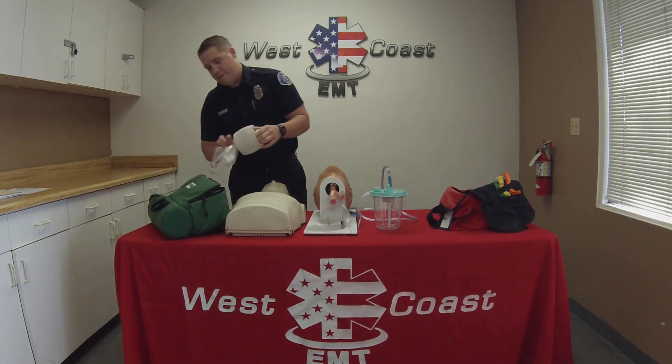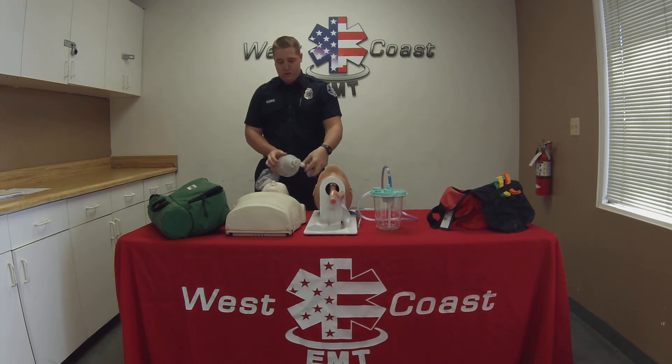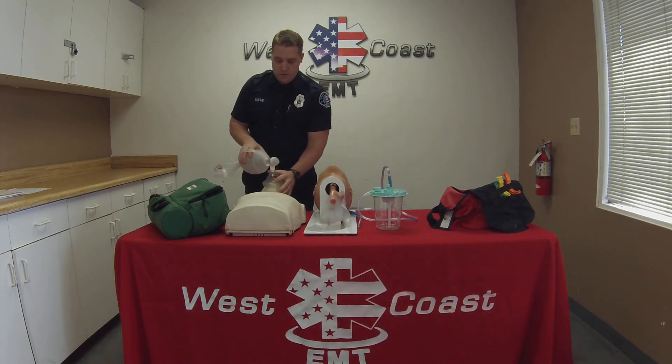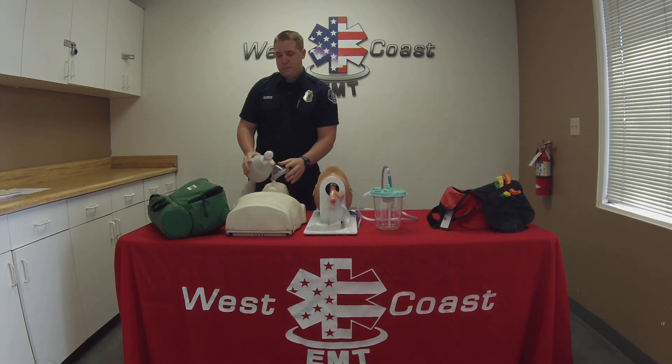I'm then going to check to see if I have established an airway after all these measures by seeing if the ventilations will go in. I'm going to open the airway again. Ventilation is being performed properly without difficulty.